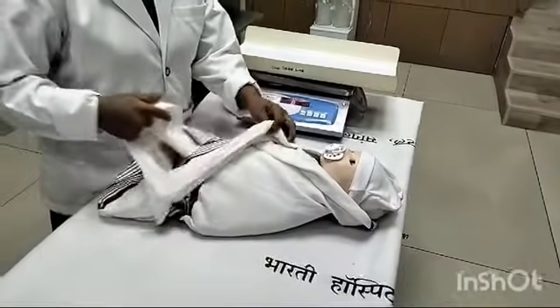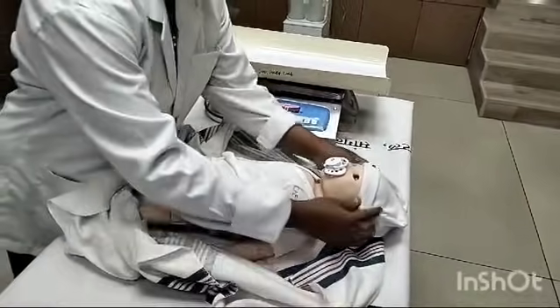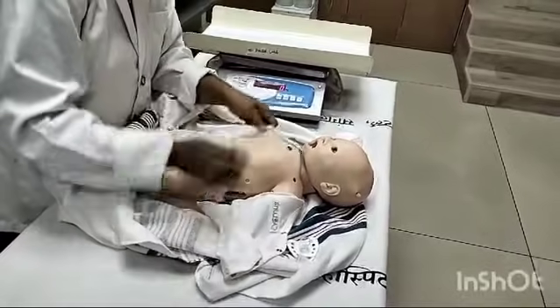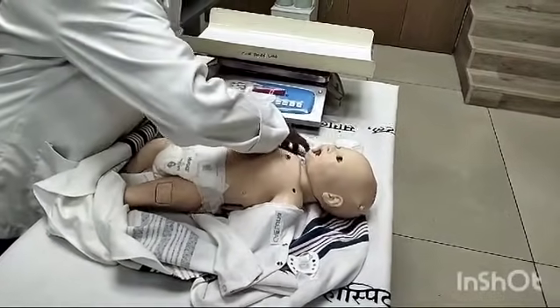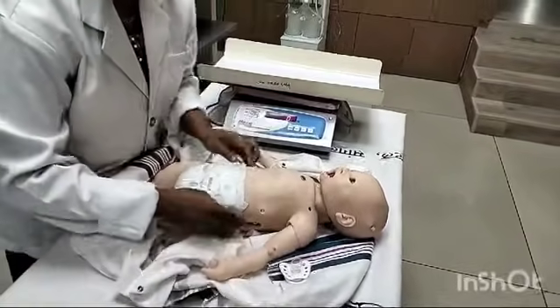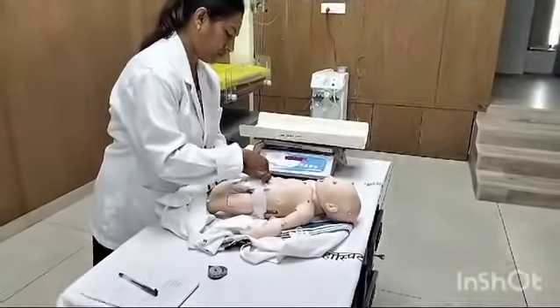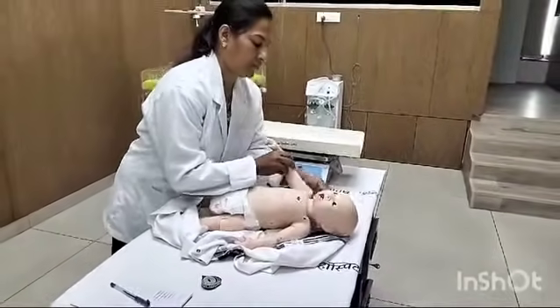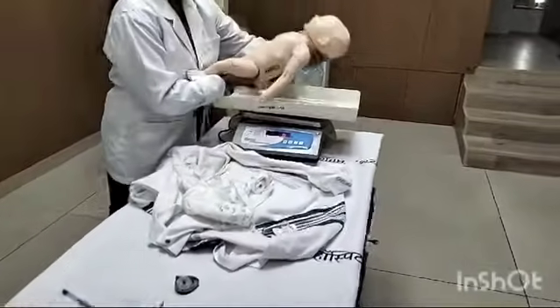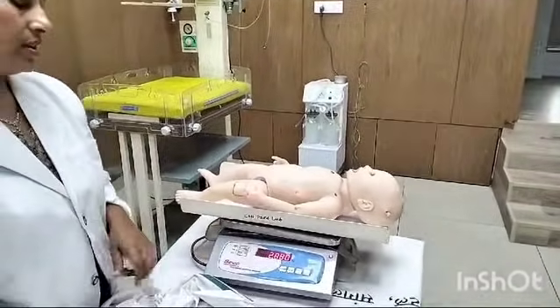Now we will see how to take the weight of the child. First, while taking the measurement, we need to remove all the clothes of the baby. Then we can keep the baby on the weighing machine, and here we will see the weight of the baby.